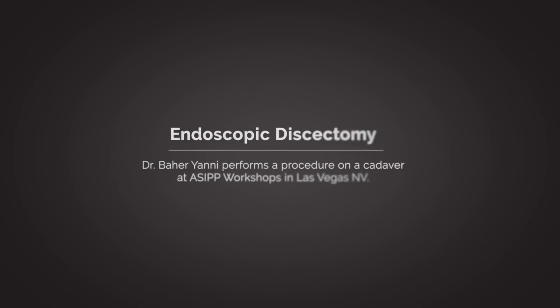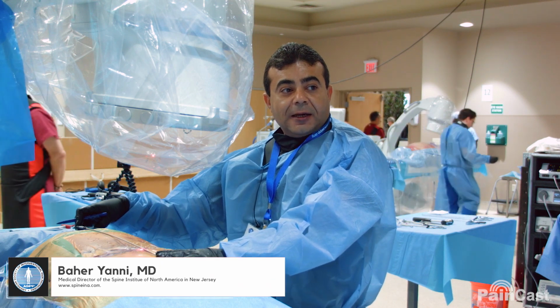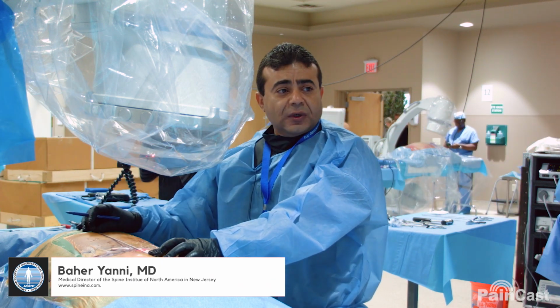This is Dr. Yanni. We are now going to discuss L4, L5 endoscopic discectomy using the Wolf system. So we start with making our markings.